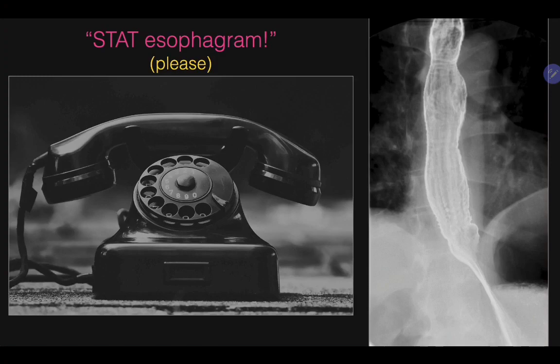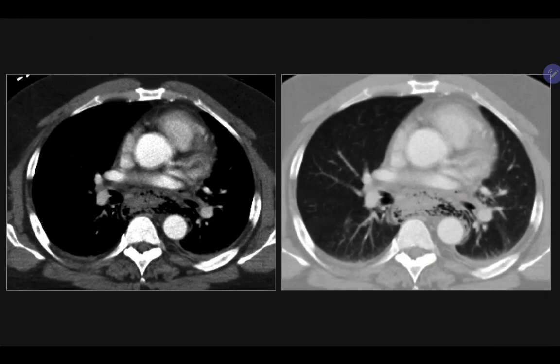This important triaging tool is looking for the size of the leak, as this helps cardiothoracic surgery know if this patient can be managed conservatively or needs surgery. Unfortunately, these exams can feel like a mess with sick patients, limited ability to drink contrast, and difficulty with positioning.